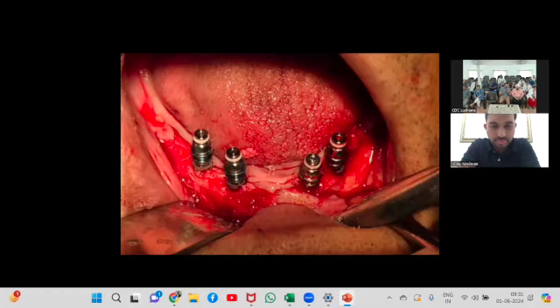And yes, we got really good implant positions. Only one was a mini implant. The others were regular implants. I remember I told him, sir, I want the implants to be like a cricket stump. It should be as straight as possible. And yes, he delivered that.